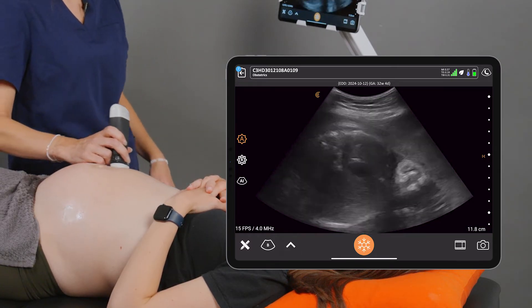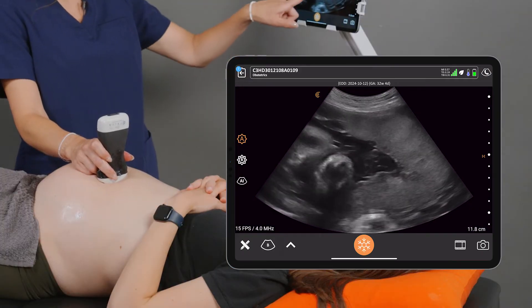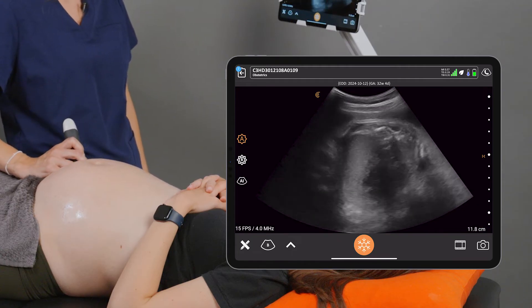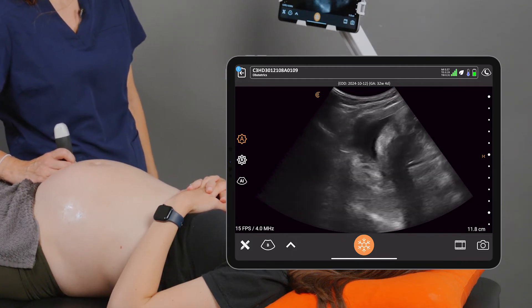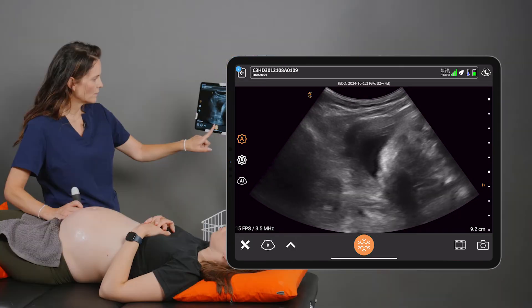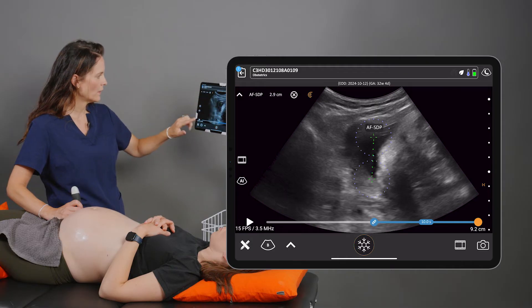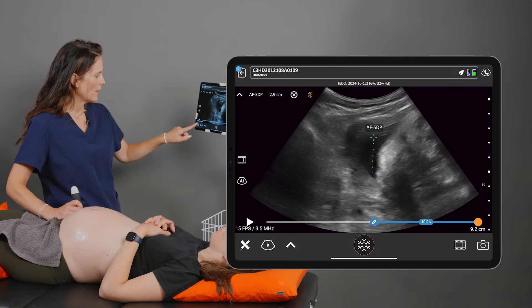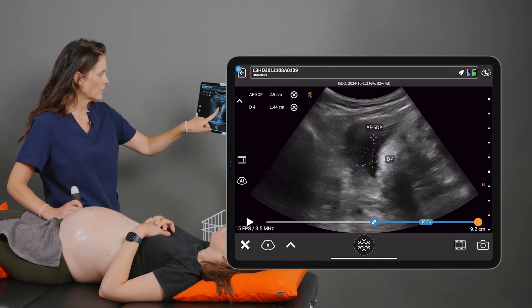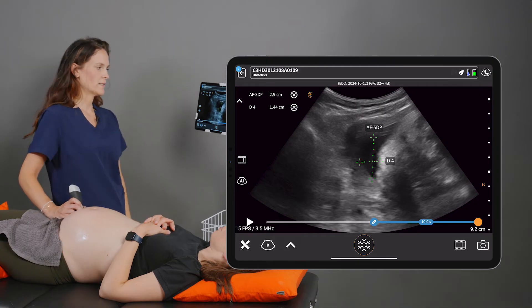In the meantime, let's have a look at the amniotic fluid volume. We're going to look for a nice pocket of amniotic fluid in an area free of umbilical cord. Here we can see a nice pocket, but it has a lot of umbilical cord in it. So we'll scan over to the lower quadrant — we can see a little pocket here with no limbs and no umbilical cord floating around. We'll freeze and take a measurement. We want it to measure at least two centimeters vertically. This one is 2.9 centimeters. We also need this pocket to measure at least one centimeter in the horizontal plane. This pocket measures 2.9 centimeters vertically and 1.4 centimeters horizontally — so that's a pass for the amniotic fluid assessment.